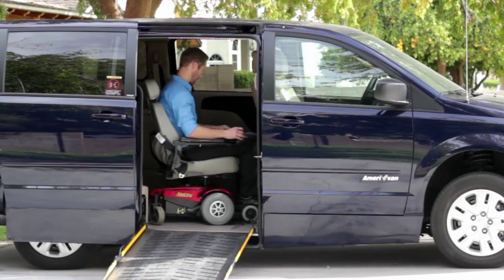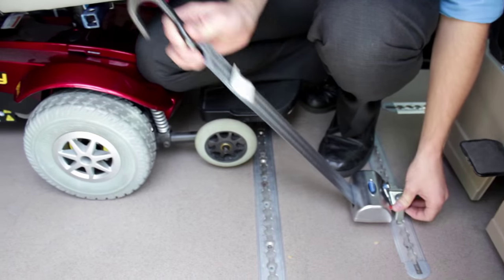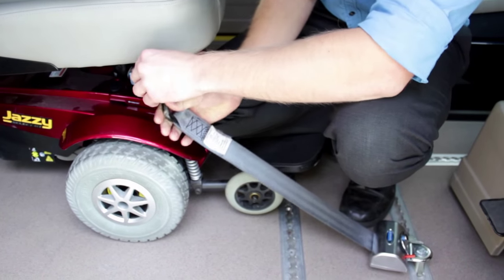Place your wheelchair and adjust the restraints if necessary. The tie-down restraints should be located at each corner of the wheelchair.